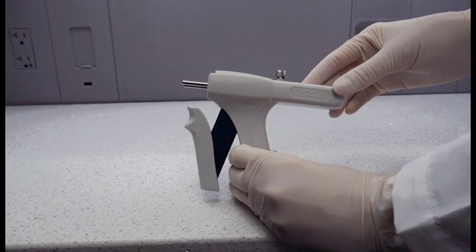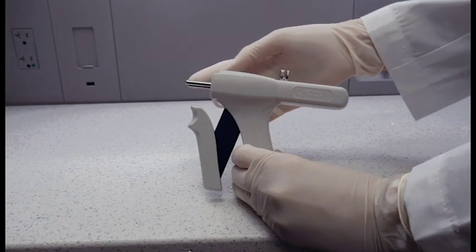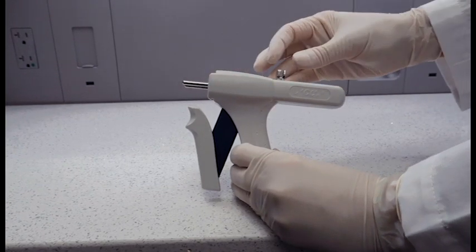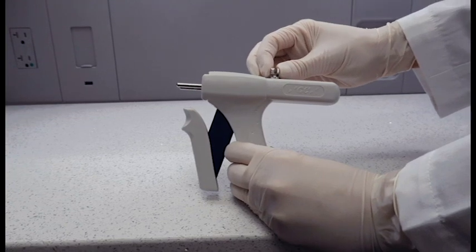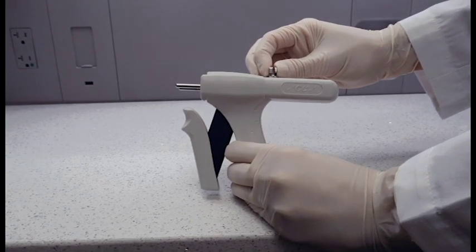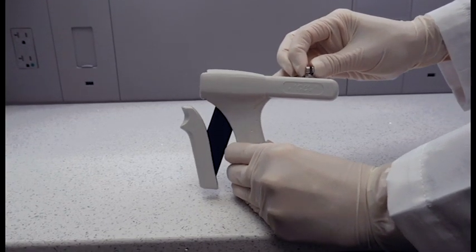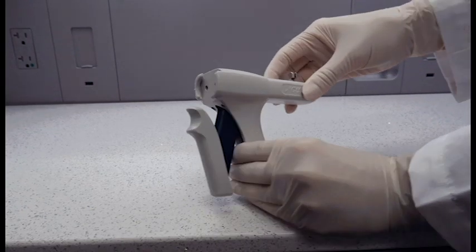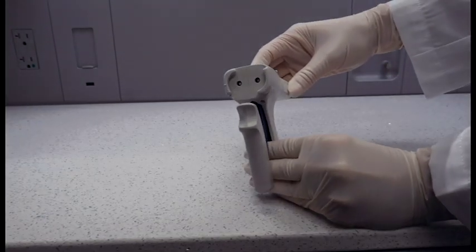First, look at the dispensing gun. If the piston is engaged or partially engaged, retract the piston back by squeezing the two metal tabs on top of the dispensing gun and sliding the piston all the way back. If this is not done, the cartridge will not seat.